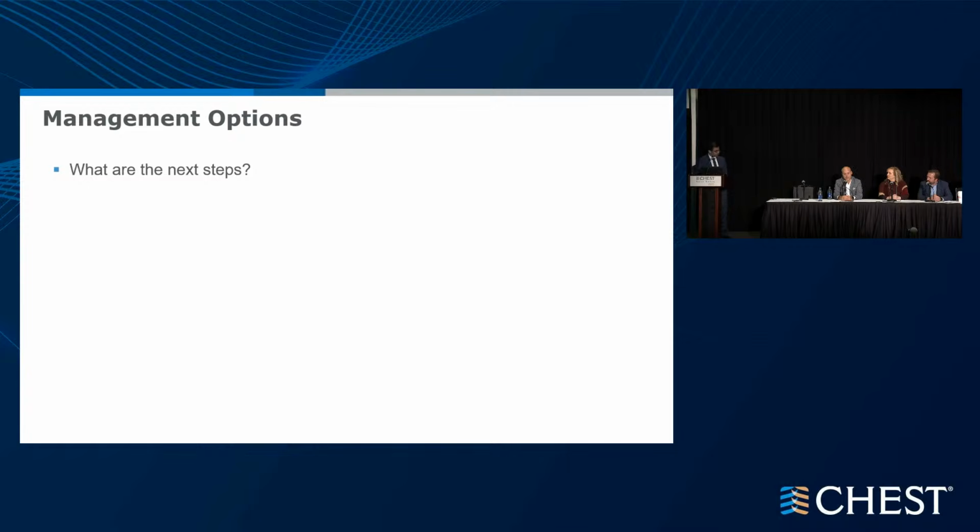Just remember, the esophagus is a virtual space. When you open it with a stent, it molds just around. So if you're really serious about fixing the fistula, leakage of fluid and secretions, you want that intimate contact between the pipe's wall and the stent wall. And that's better with an esophageal stent than with an airway stent, where you have a mismatch between the shape of the airway and the shape of the stent.